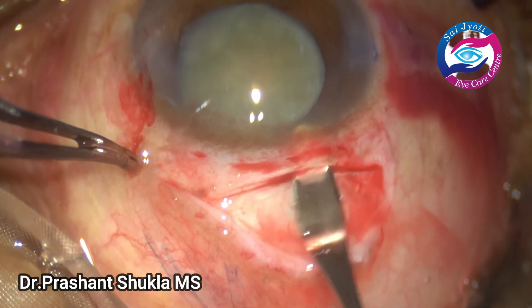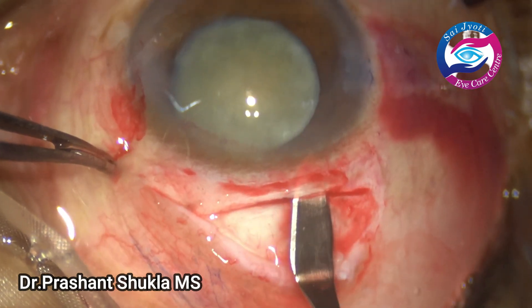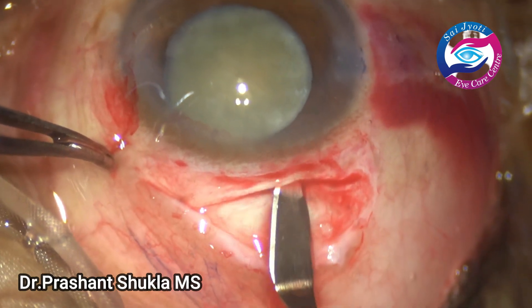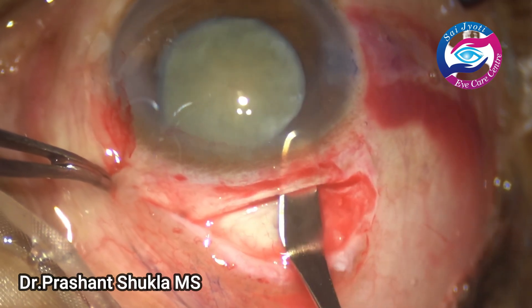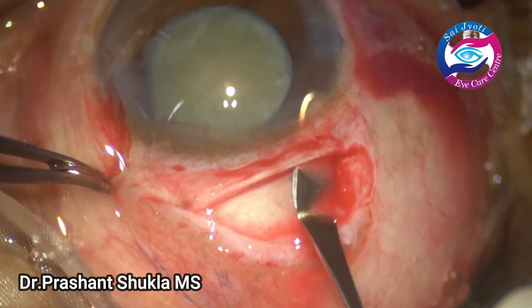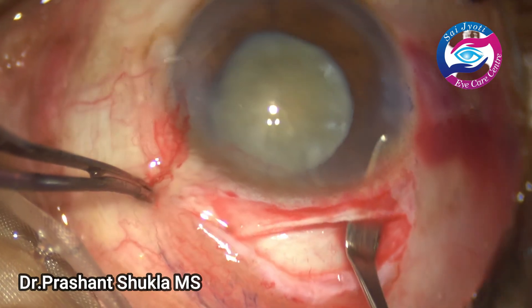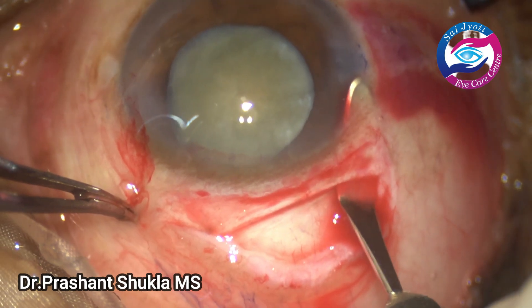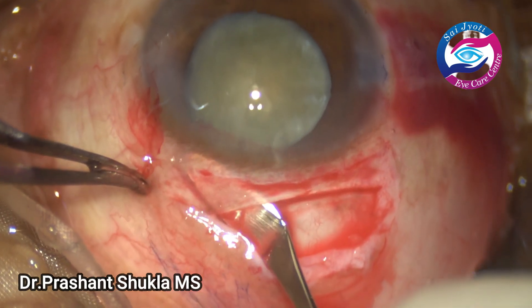Now on the right side the same wriggling motion is used. The bevel of the crescent is kept up because we don't want premature entry at any point, as premature entry risks iris prolapse during surgery and makes the operation more difficult. A very nice scleral tunnel has now been created.